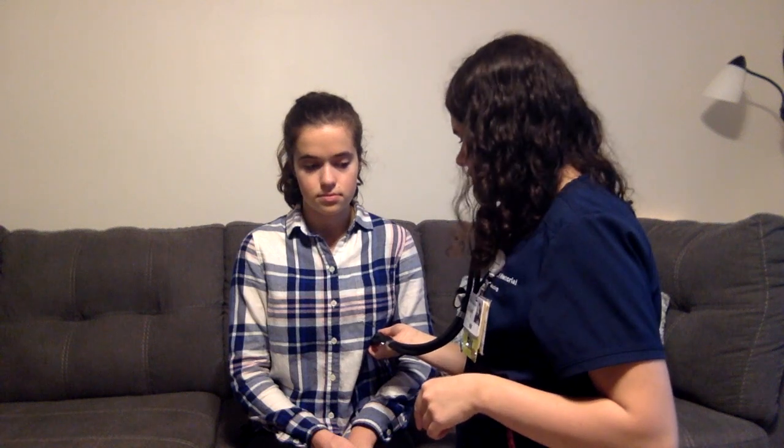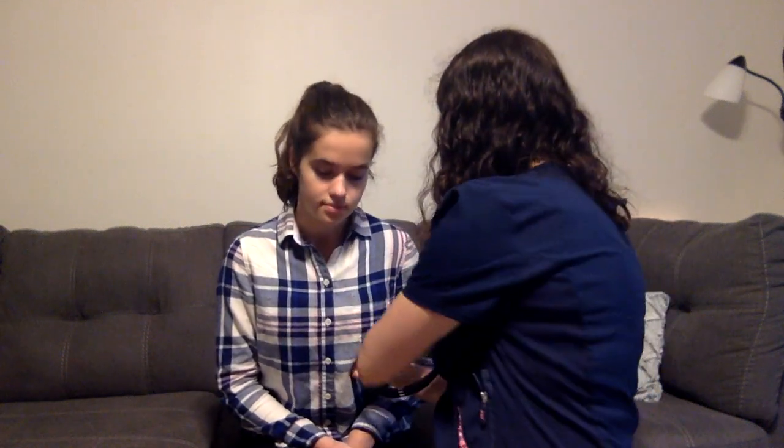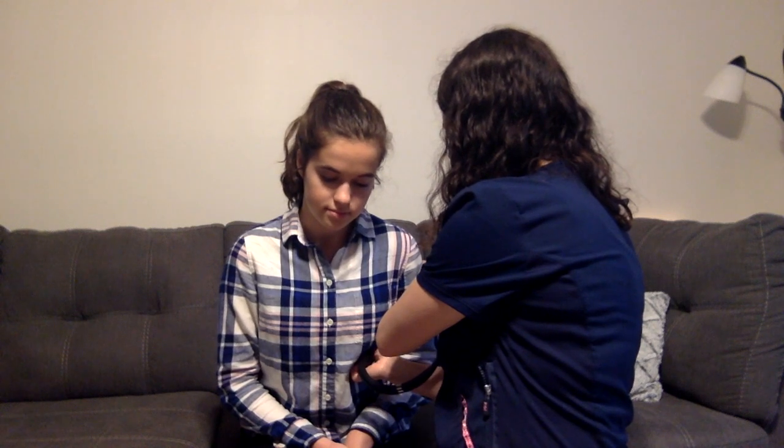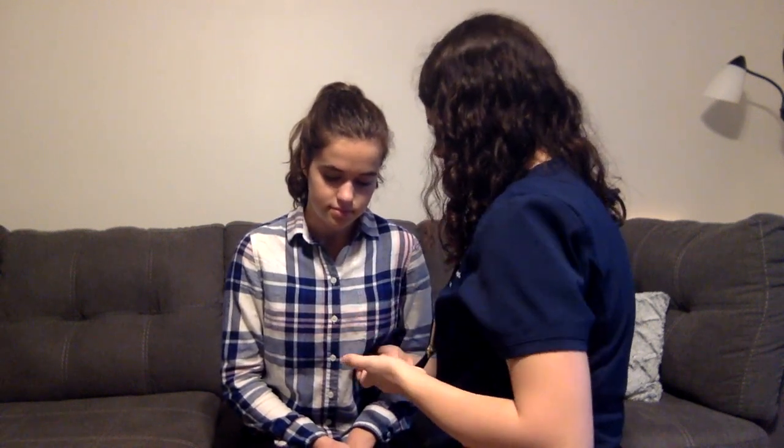Then the fourth intercostal space is where you'll hear the tricuspid valve. And the fifth intercostal space on the midclavicular line is where you'll hear the mitral valve. And sometimes it can be hard to hear, so if you have the patient sit forward a little bit, and you use the bell of your stethoscope, you can hear it a lot better. It helps to bring the heart closer and out front.